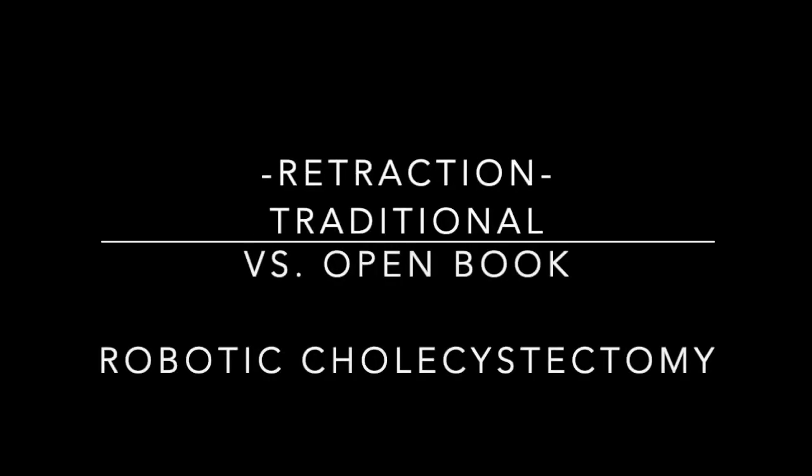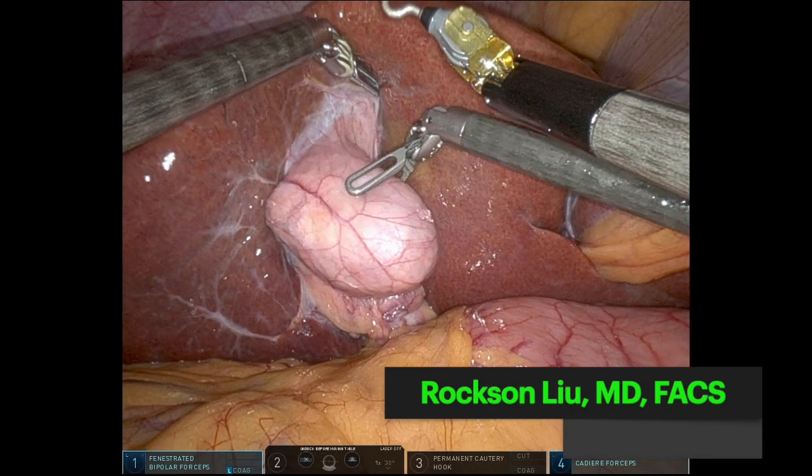This is Roxen Lue from Oakland, California with a quick video on my open book retraction technique versus traditional technique in robotic cholecystectomy.